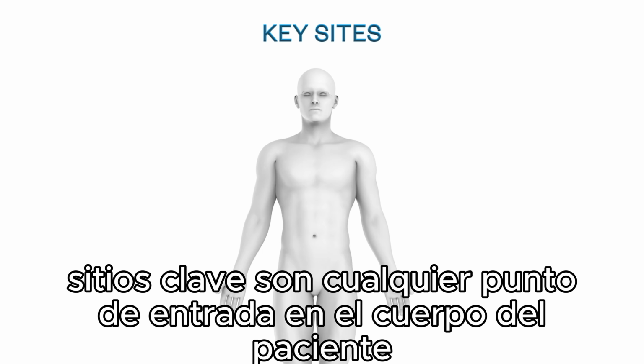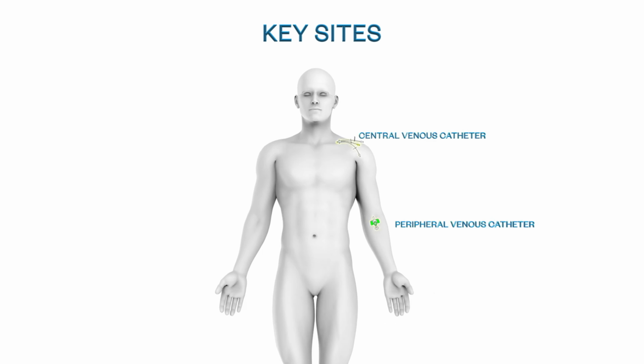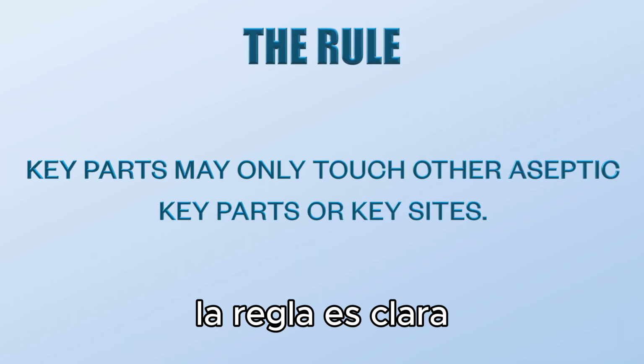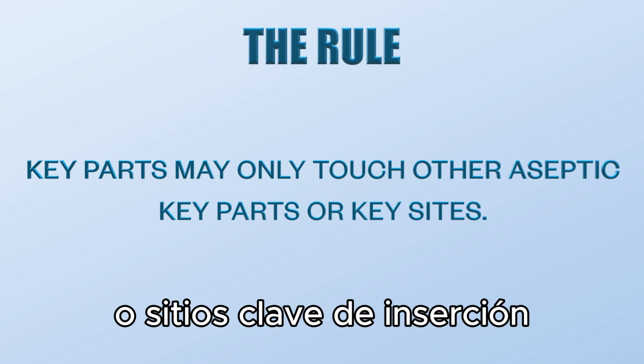Key sites are any entry points into the patient's body where microorganisms can enter. An example would be the insertion site for a central venous catheter or the skin over a port before inserting a port needle. The rule is clear. Key parts may only come into contact with other aseptic key parts or key sites.